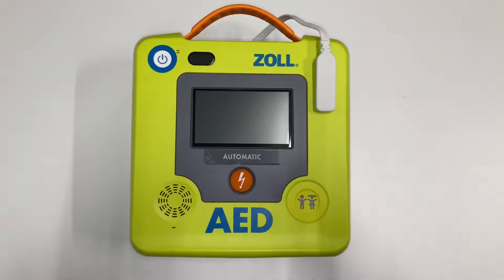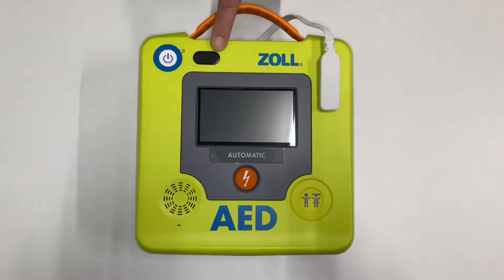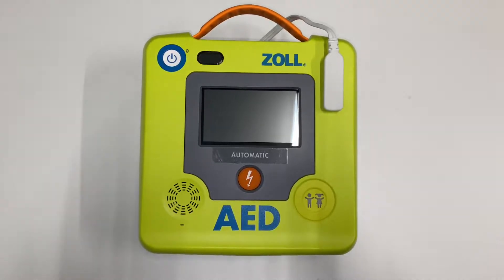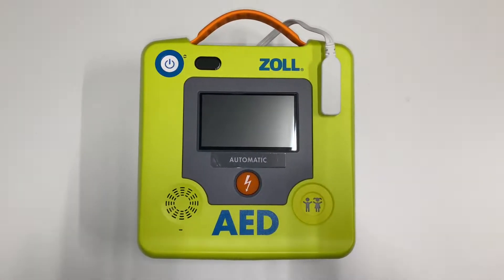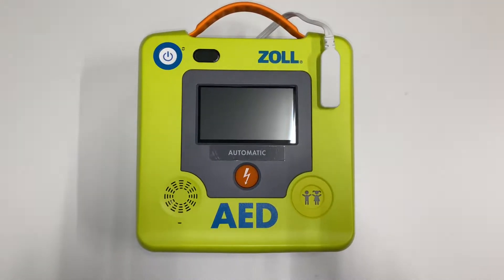Here's a Zoll AED3 defibrillator. It currently does not have the green tick in the front-facing window, which is most likely because the battery is running low. This video will show you how to change the battery on your Zoll AED3 defibrillator.